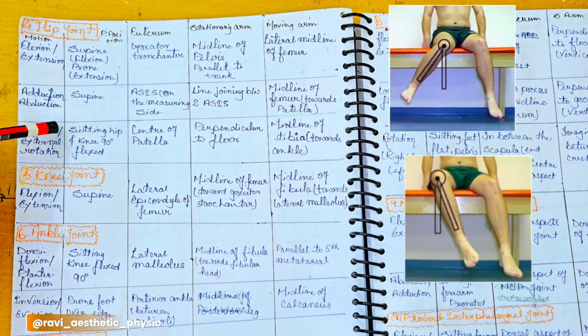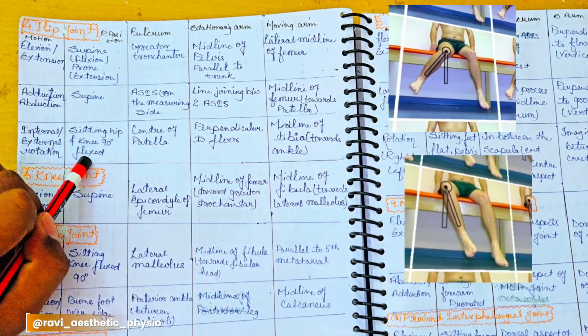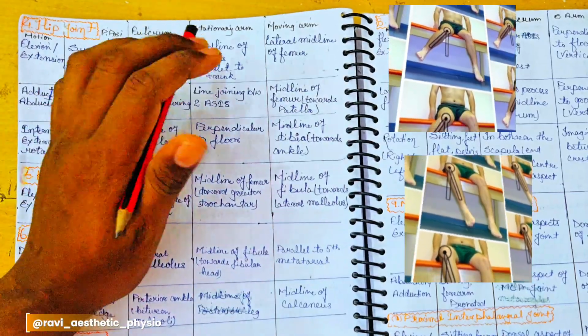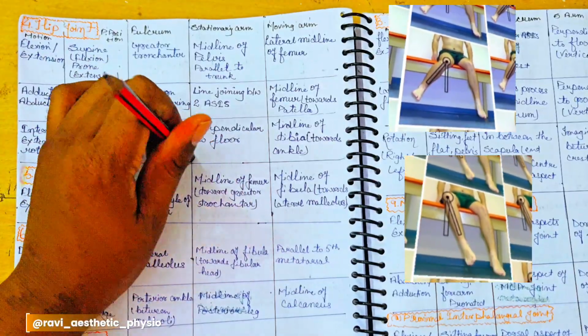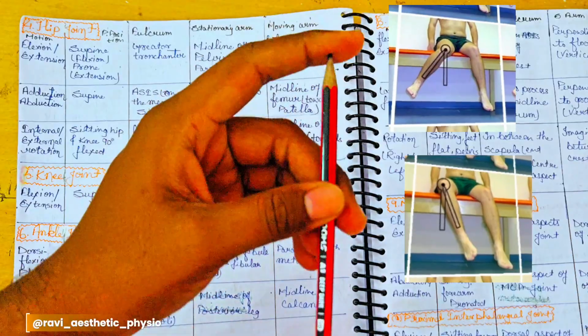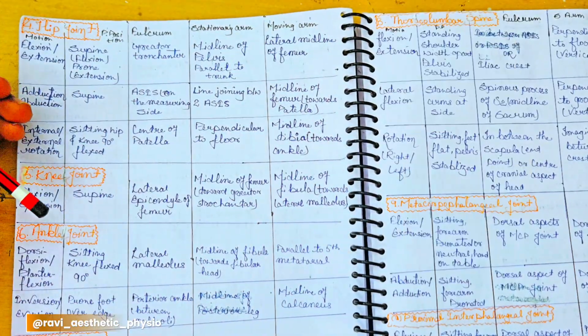Internal and external rotation you can measure in sitting, with the hip and knee joints at 90-degree flexion. The fulcrum is placed at the center of the patella, perpendicular to the floor, which is the stationary arm. The moving arm is along the midline of the tibia towards the ankle joint, and moves with the tibia. I have to check internal or external rotation. So if the patient is sitting on the table and there is movement of the tibia, we can measure internal and external rotation. Next, we come to the knee joint.